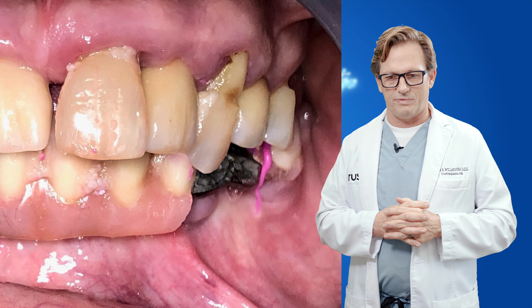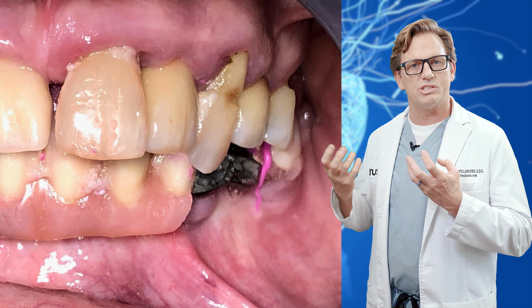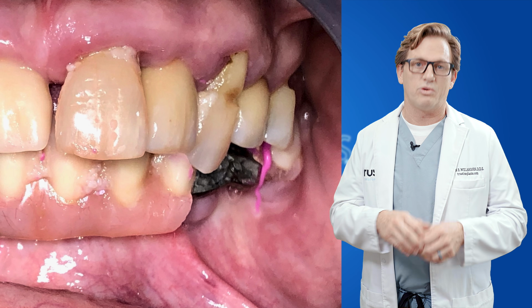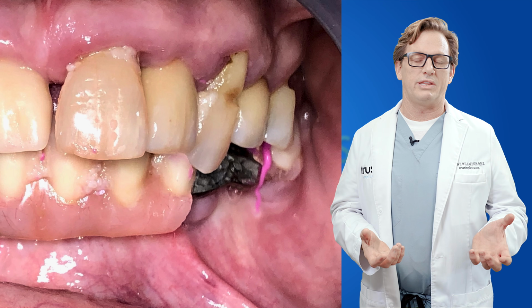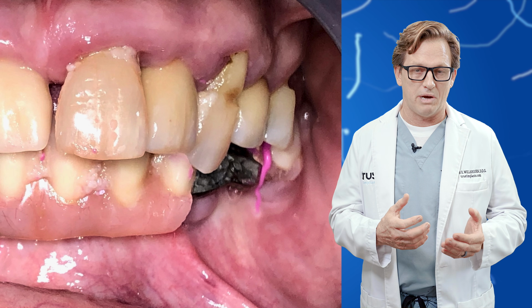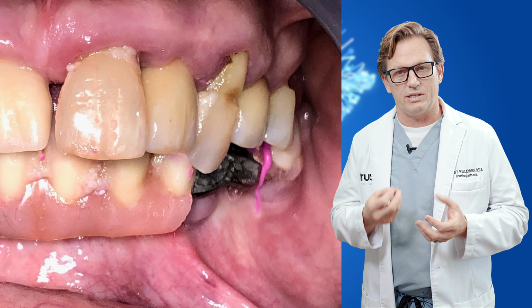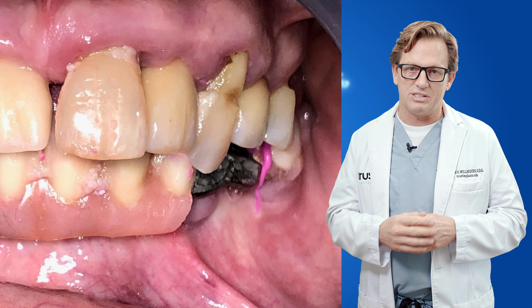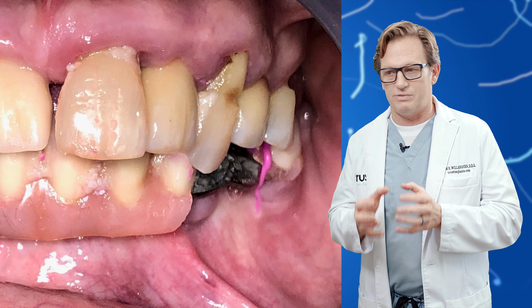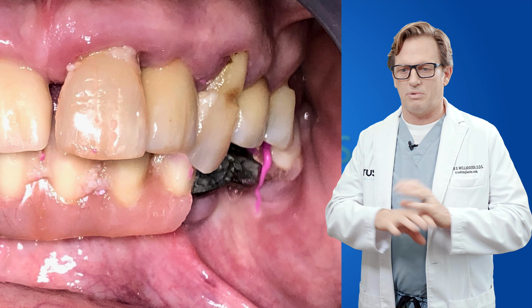And you can see, here's the before photo. So take a look at this. The bridge is falling apart, but look at this metal here. Look at how it's tarnished. It's actually there, so the type of material used on the framework underneath the bridge, who knows what that is? I mean, whether she's getting a galvanic shock or reaction, and a chronic one, by the way, because with galvanic shock, you get this chronic kind of electrocution in the mouth because it's a wet or aqueous environment. And so any sort of metal is very reactive in the mouth because it is a wet environment. And of course, the prosthesis is falling apart.